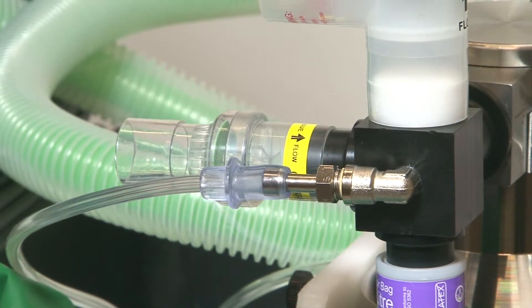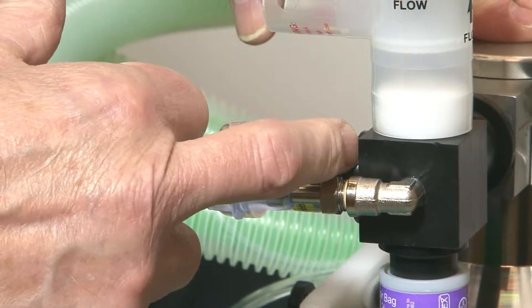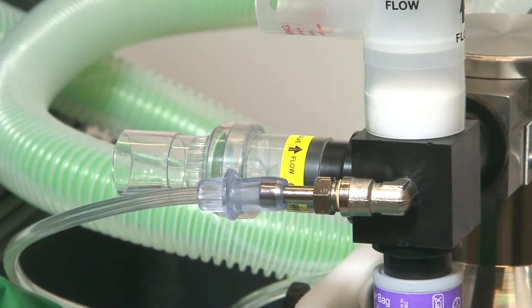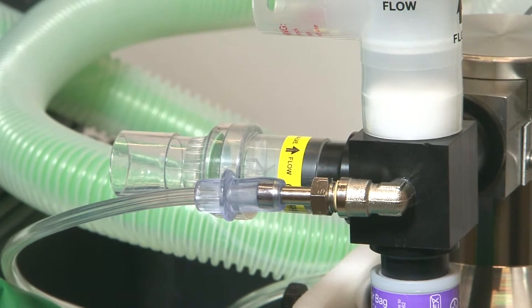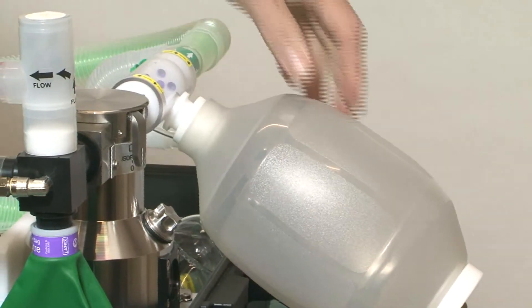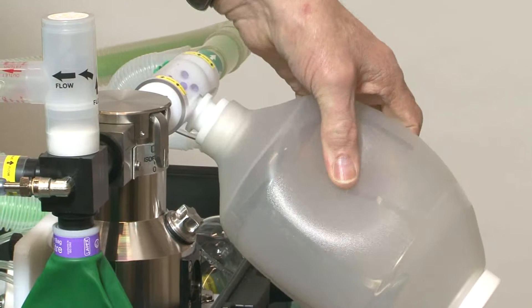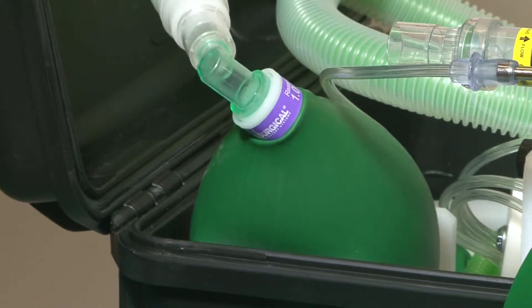The gas flow in the circuit works by entraining air through the one-way valve at the back of the reservoir block. This is either controlled by the patient's own inspiratory effort when spontaneously breathing, or through controlled manual ventilation by the anesthetist squeezing the self-inflating bag.